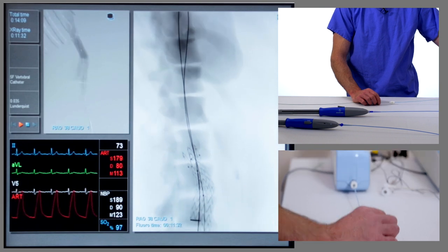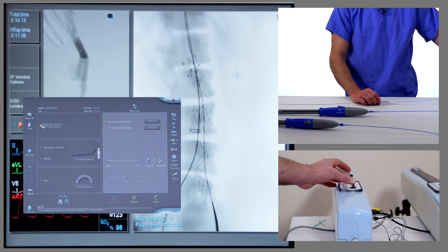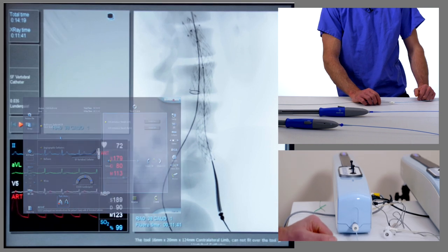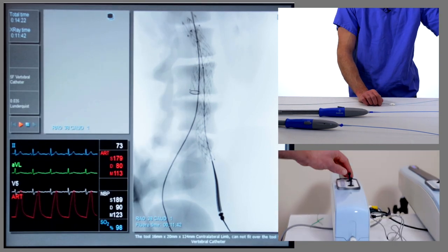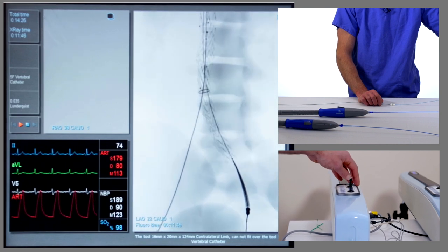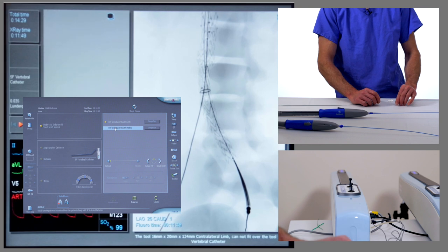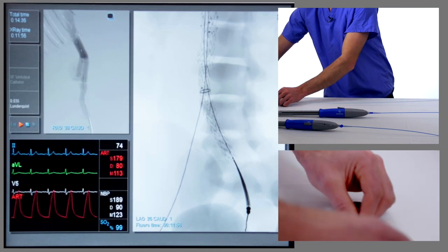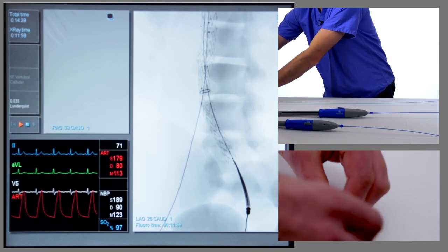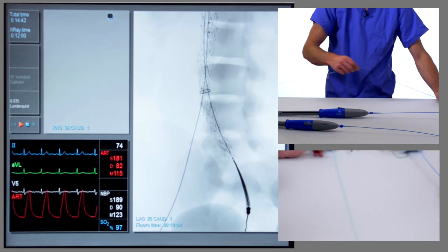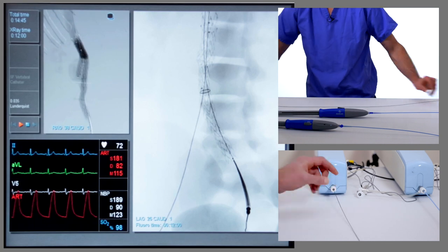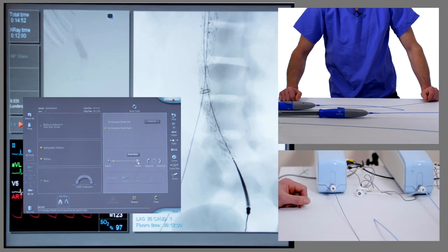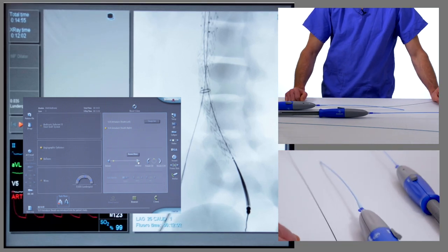We now recentre back over the abdominal aorta. The important thing is to identify the iliac bifurcation on this side, so we change the angle — typically coming into a left anterior oblique. We remove the vertebral catheter and insert a 16 French sheath into the right groin. 16 French because the outer diameter of the delivery system for this contralateral limb is 16 French, though it varies depending on the size of the limb. The 16 French sheath gets inserted and the introducer is removed.